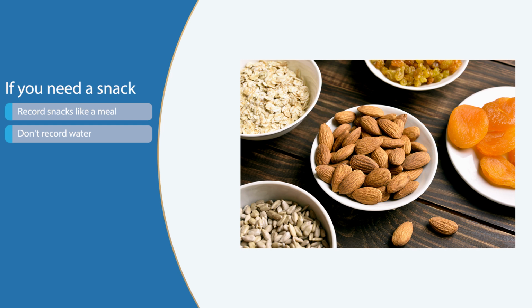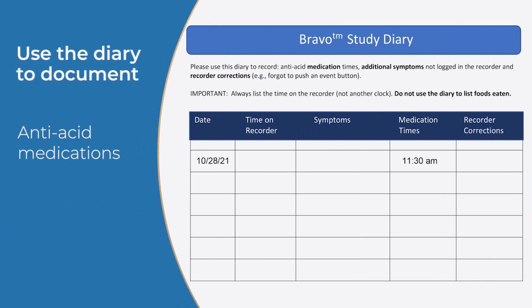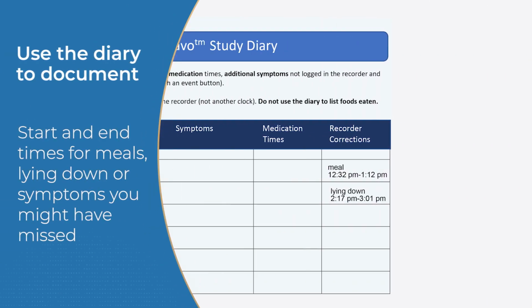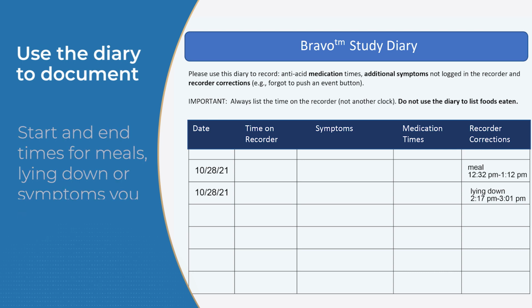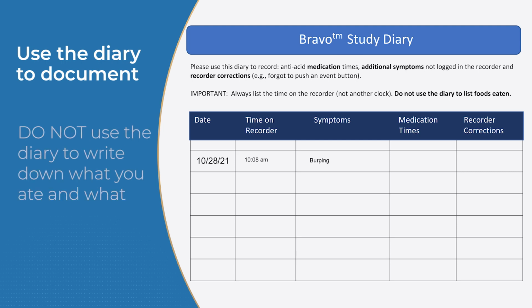Now let's discuss how to use your diary. The diary is used to document only three things: when you take antacid medications, events you forgot to capture on the Bravo recorder, and any additional symptom that wasn't assigned a button. The diary is not intended to be a food journal, so do not write down what you ate or drank.